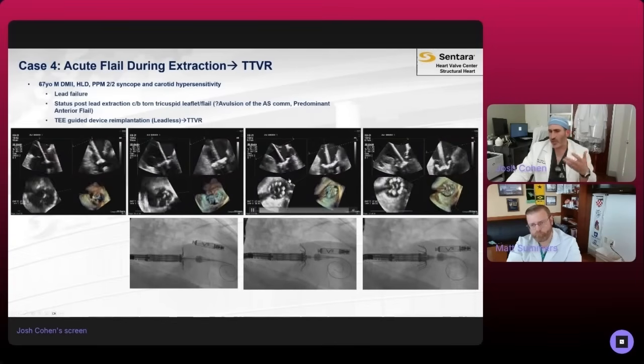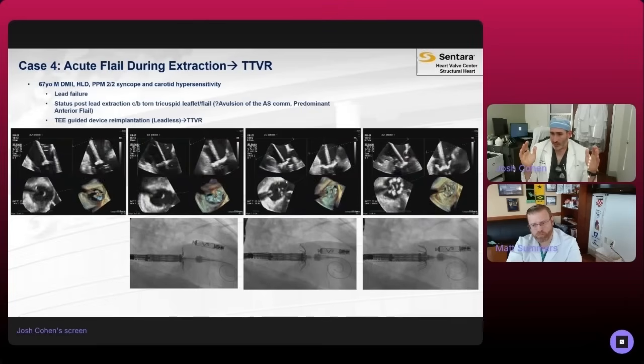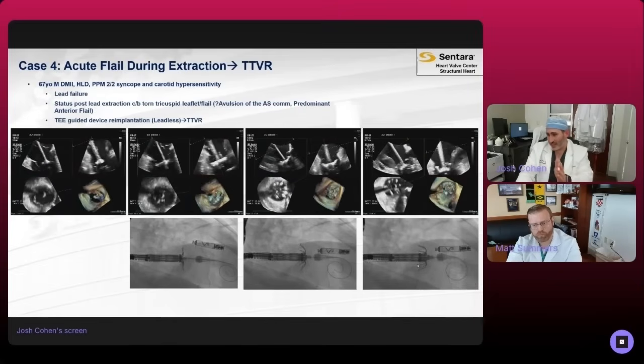And we're kind of calling that out as a procedure, or during the procedure. And then each stage of the way, we're kind of coming up closer to the annulus, making sure that we have capture, and then really just working on trajectory to make sure that we're going to abut the annulus both septolaterally and AP. And then you essentially deploy the device, and you kind of see the fluoro correlates here of what those arms are doing, and kind of the relation as well to the AVIR. And it's really kind of nicely positioned to not interact with that.